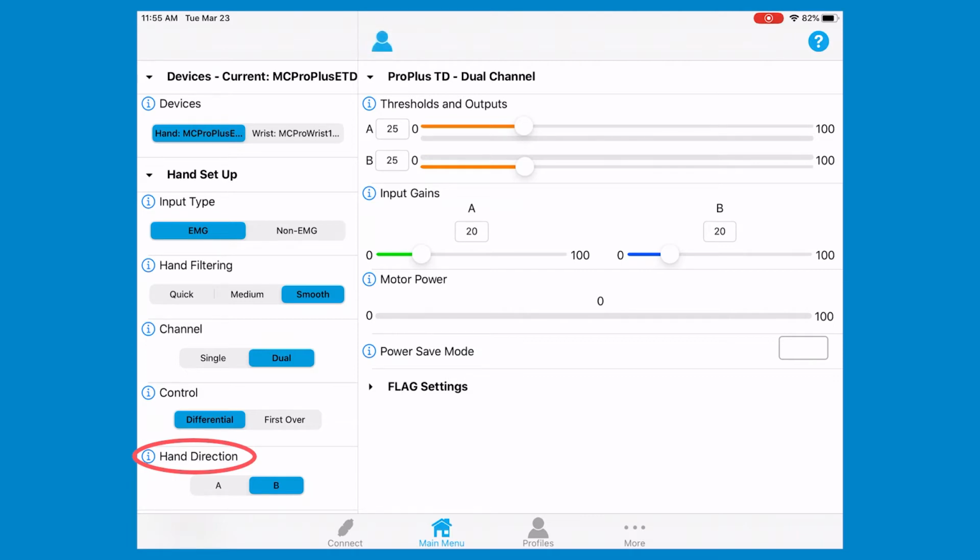Also, my fictional patient does not know what muscles make the hand open or close. This lays the groundwork. They learn wrist extension opens the hand, wrist flexion closes the hand. Soon I'm going to change my words to hand open, hand close, once I'm sure it's wired correctly and the patient understands the muscles involved in opening and closing.